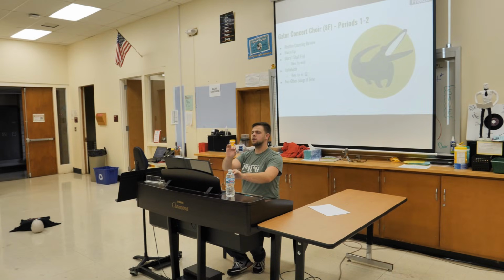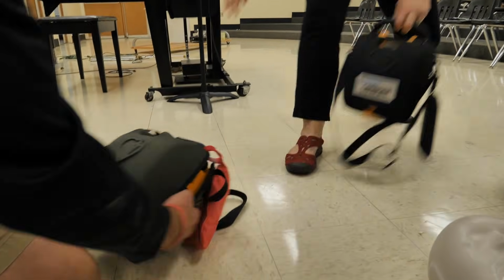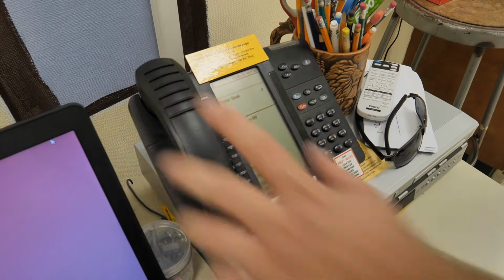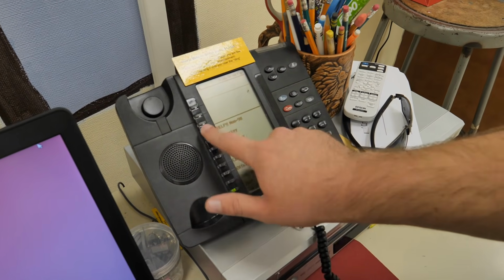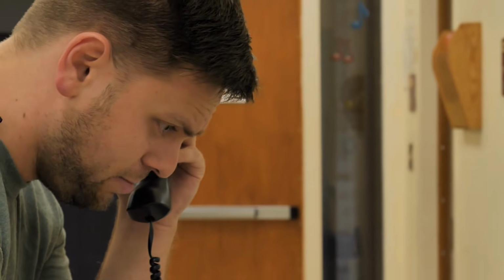So let's review what we just saw. The site coordinator should place a mannequin on the floor and have the AED training unit available when the real unit arrives on the scene. Switch out the training unit for this experience. Have the first person on the scene call the front office advising them that this is only a drill. Tell them you have an unresponsive victim and give your location. Your plan now goes into effect.